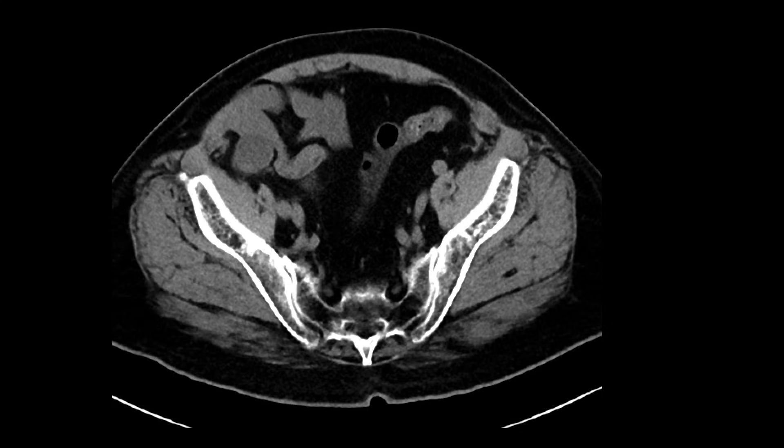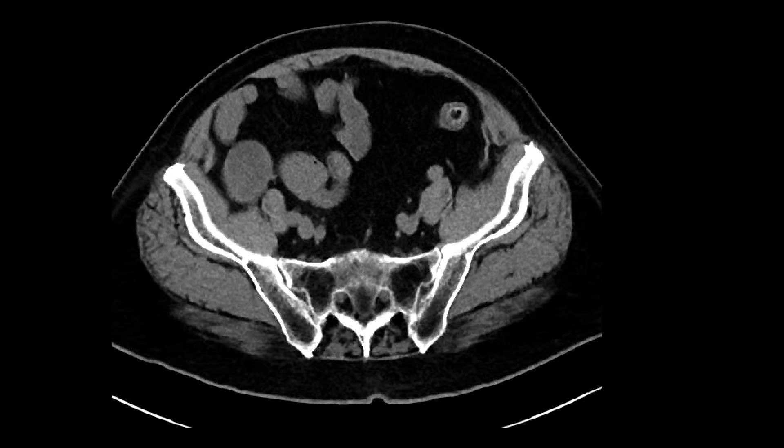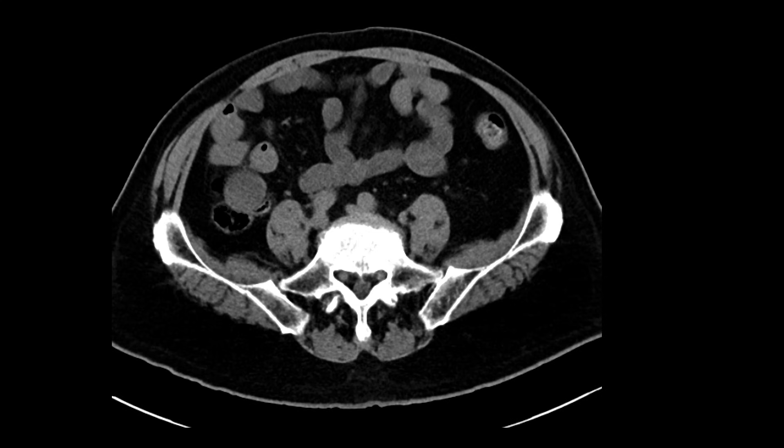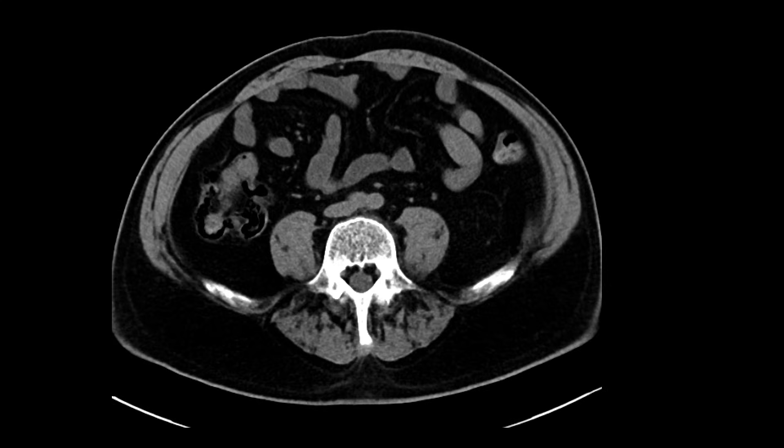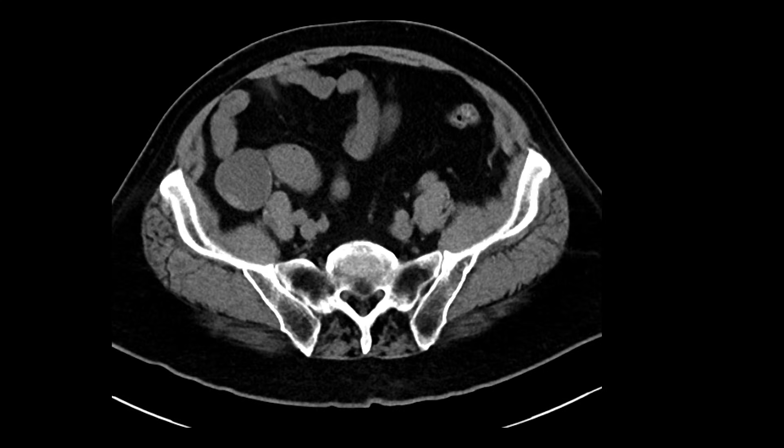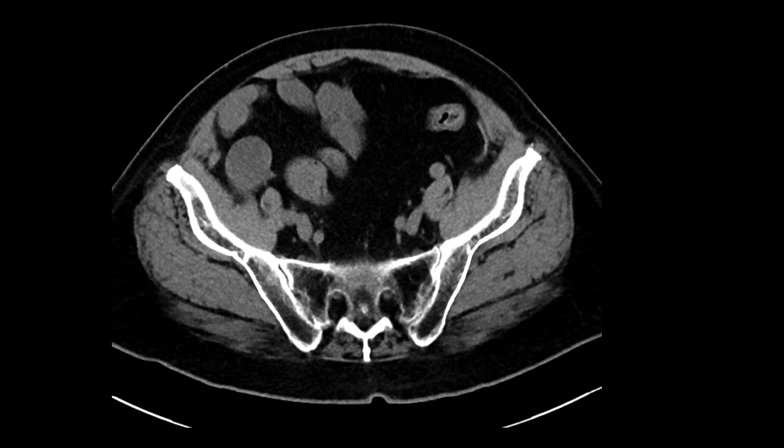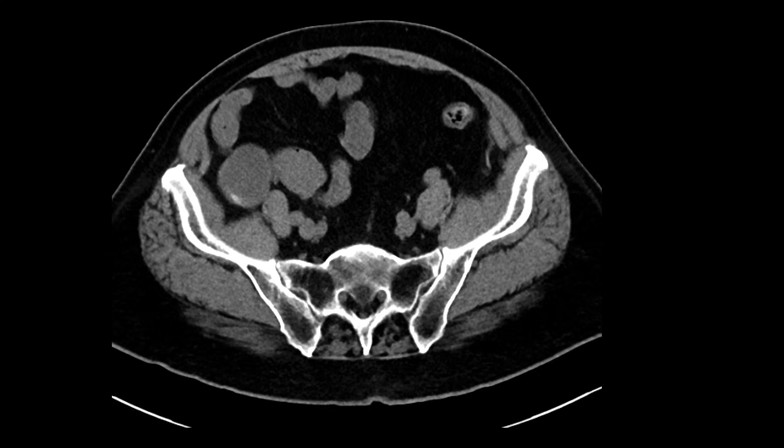A number of causes can result in this, including underlying neoplasms. This was incidentally picked up in this patient who was having a little bit of flank pain.